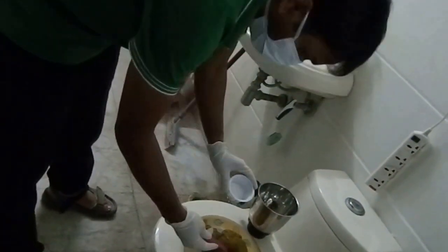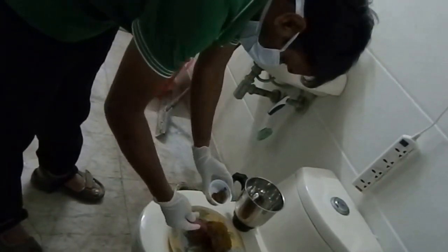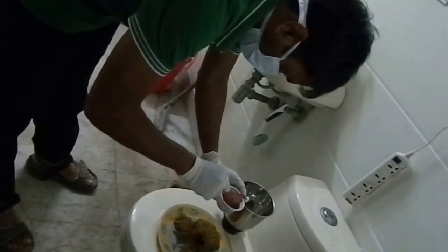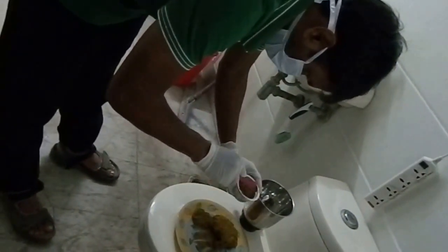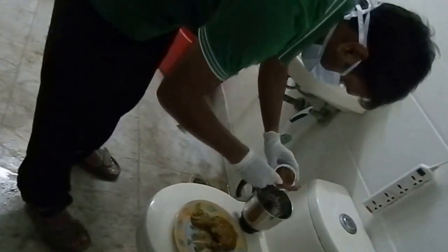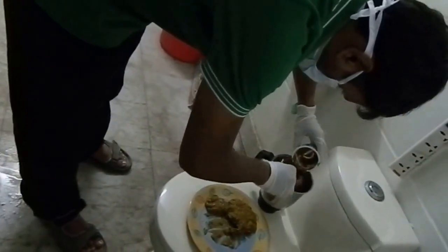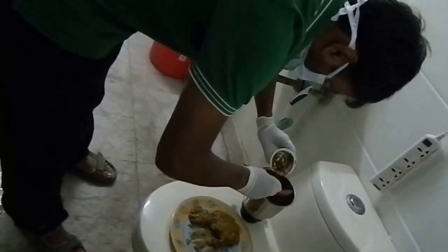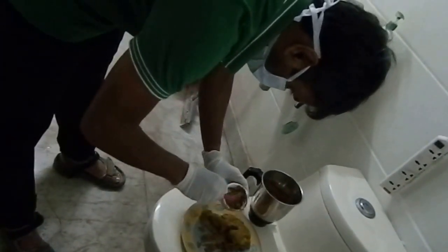We use the spatula — all of this is already washed with saline. As you can see, the fecal matter is measured in a cup and taken out before putting it in the mixer grinder. Now it is being put in the mixer grinder. Of course the measurement cannot be accurate but it will give you some reference.